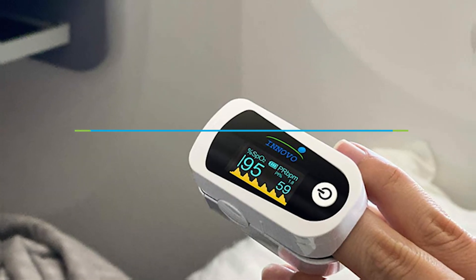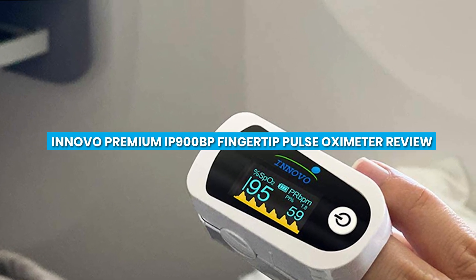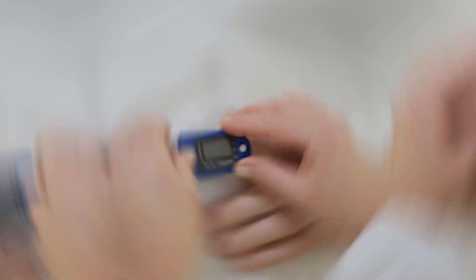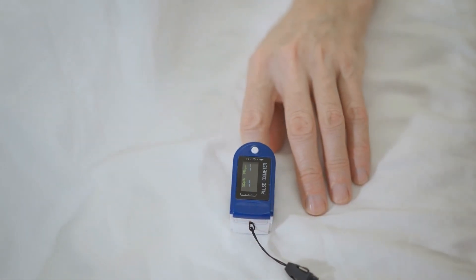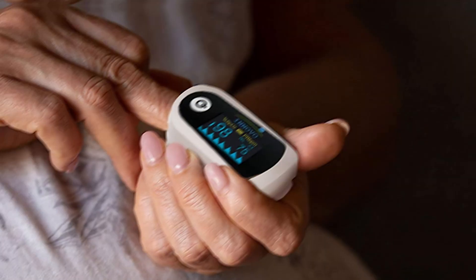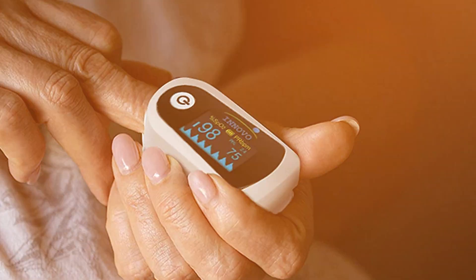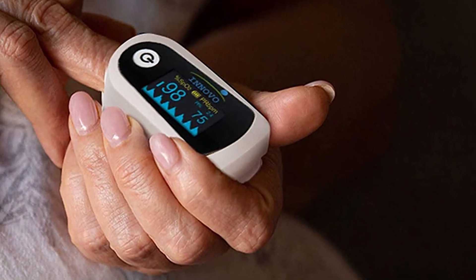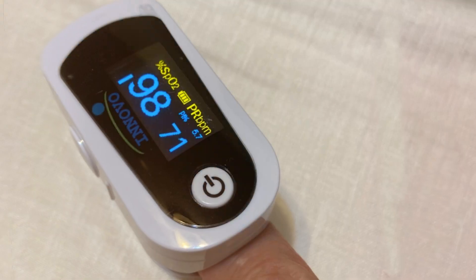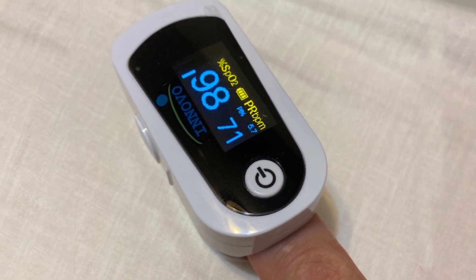Welcome to our review on the topic of the Innovo Premium IP900BP Fingertip Pulse Oximeter. Monitoring your oxygen saturation levels is crucial, especially for individuals with respiratory conditions or those engaged in high-altitude activities. In this video, we'll explore the features, performance, and user experience of the Innovo IP900BP Pulse Oximeter. Let's dive in.